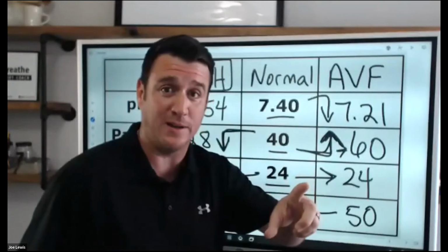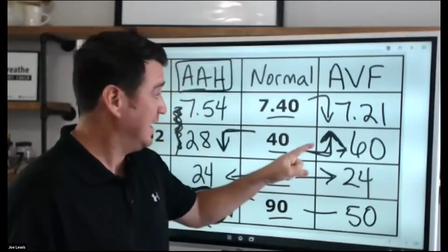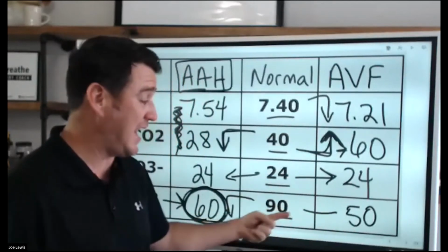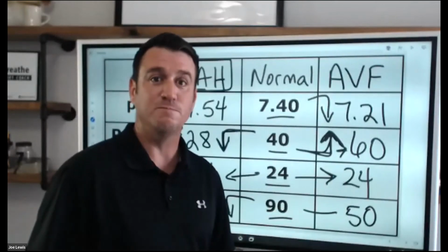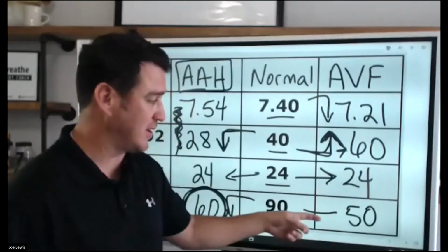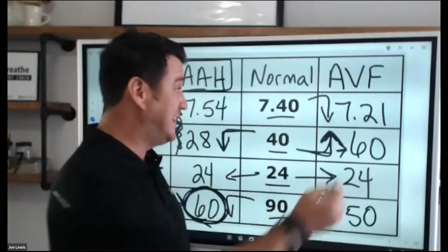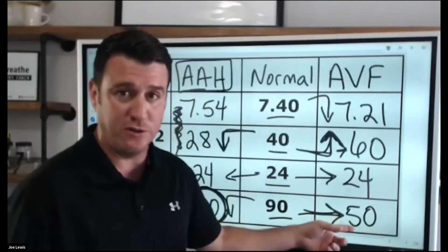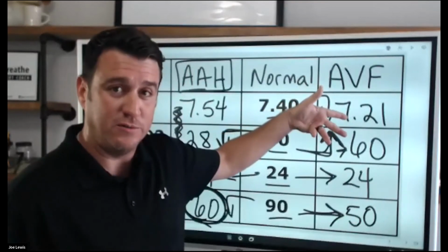Guess what else is happening? The hypoventilation that is now present is causing the hypoxemia to worsen. So you see now where our O2 is even less. What are we going to fix now? You want to put this person on oxygen? Absolutely not, because we know that in this situation, fixing their PaO2 will not aid them with the removal of the CO2.